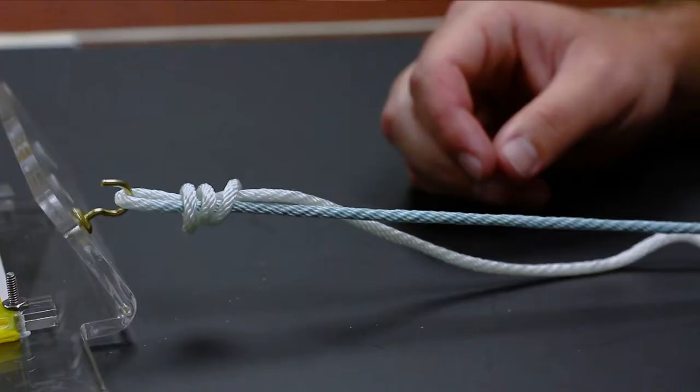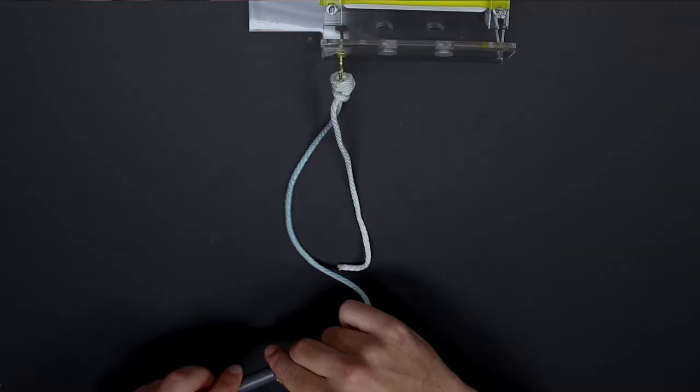We can then dress the knot prior to placing it through the cannula and we pull it against the tissue by pulling on the post.